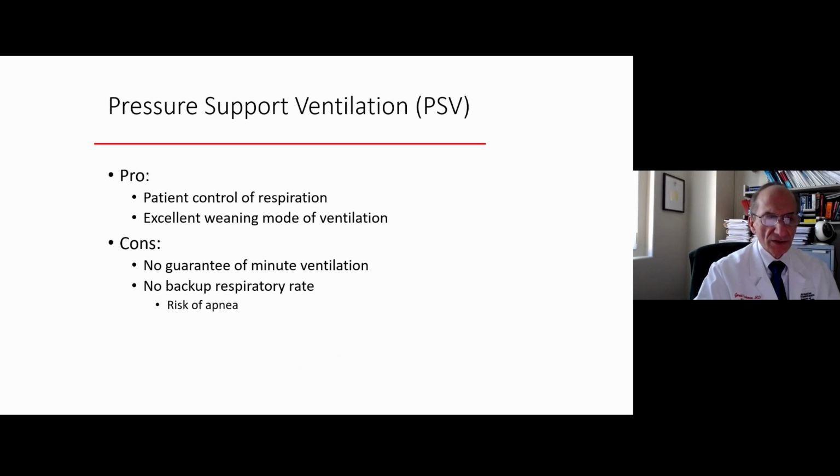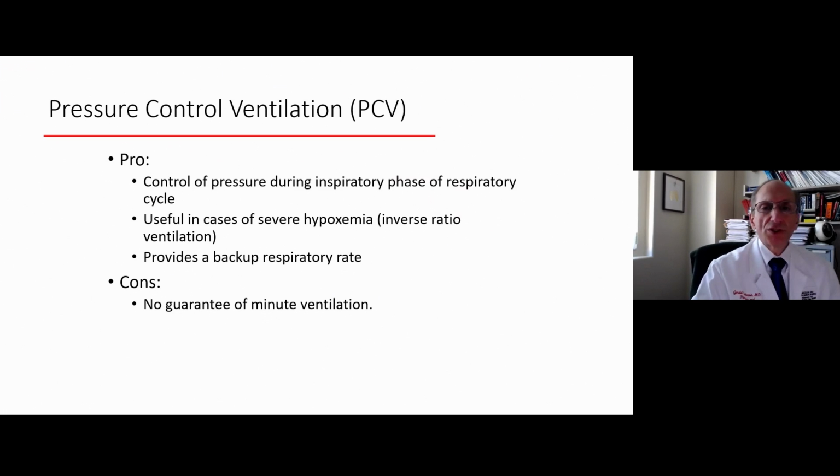The downside, of course, is that there's no guaranteed minute ventilation. So if for whatever reason their breathing rate declines, then they will simply have less minute ventilation, and there's no backup rate for this. So it's usually only used for people who are initiating breaths and on recovery.